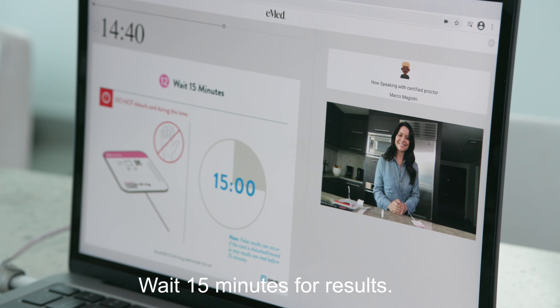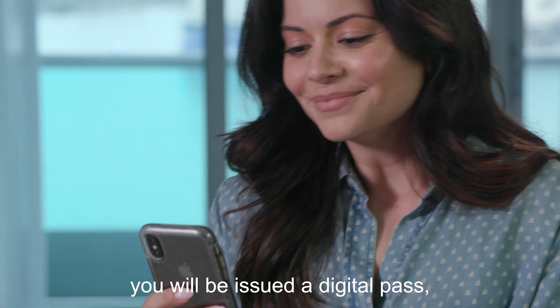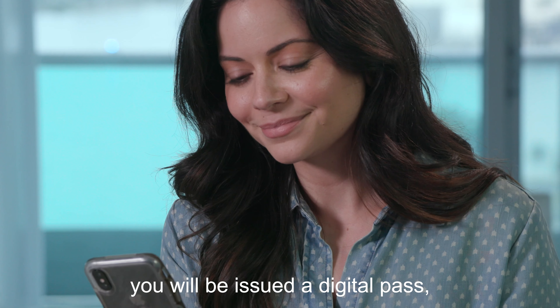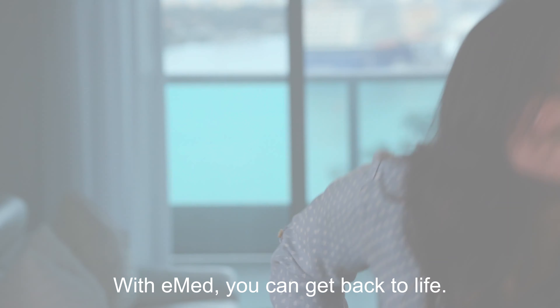Wait 15 minutes for results. After you have taken your test and with a negative result, you will be issued a digital pass accessible through your companion app. With eMed, you can get back to life.